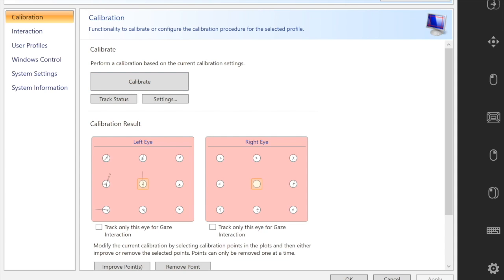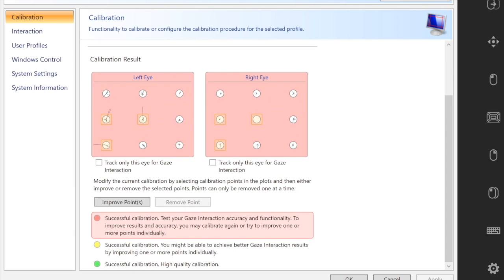Now I'm going to select those individually so that I can recalibrate those points to improve my overall calibration results.